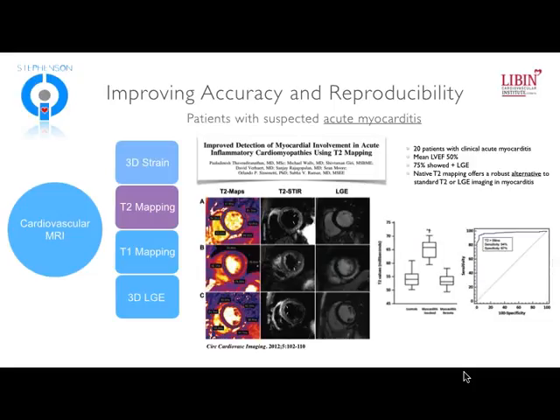If you look back in 2012, there was a study by Dinesh, actually, who's in Toronto, who was working with the group of Dr. Rahman and Simonetti, and in 20 patients showed that the use of T2 mapping was able to identify some significant differences between people with acute and resolving myocarditis versus controls, and indeed had a very robust area under the curve for the prediction of abnormal other tissue characterizations such as late gadolinium enhancement.